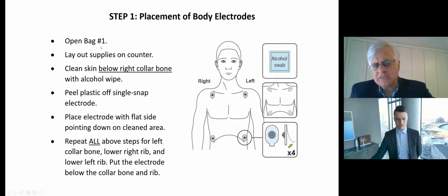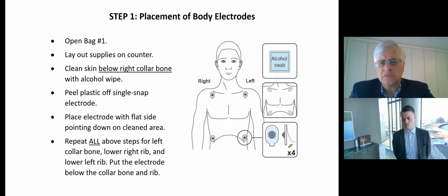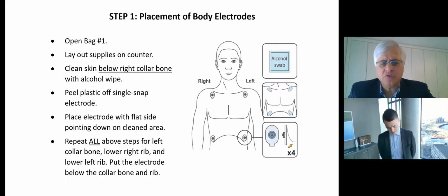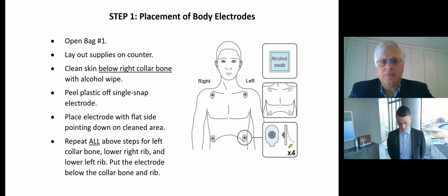Now, Nox has since migrated away from bags and developed an even more efficient kit. But for the MAX study, we used this platform of electrodes being partitioned in different color-coded bags, so it'd be easy for the individual to pull them out of the kit and apply them.